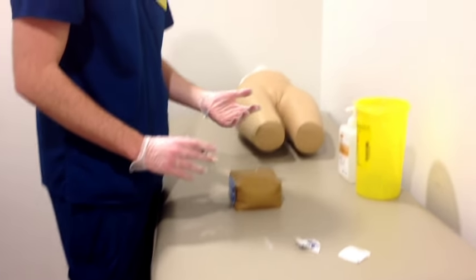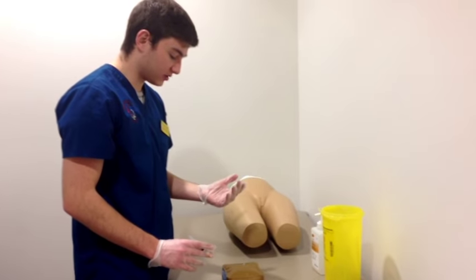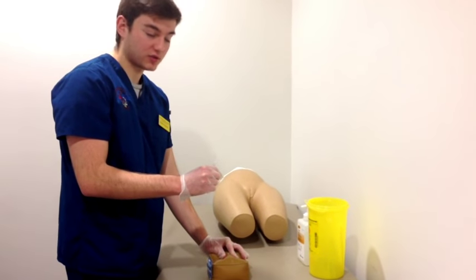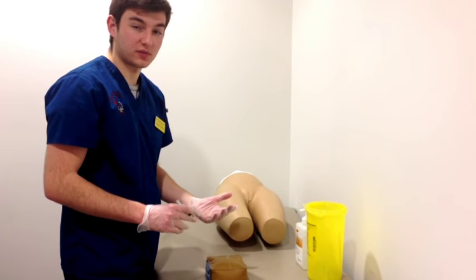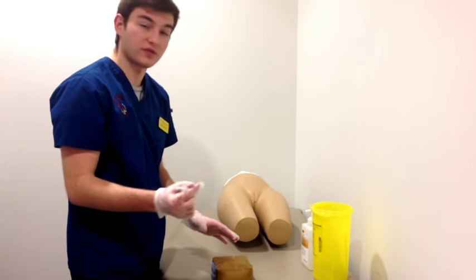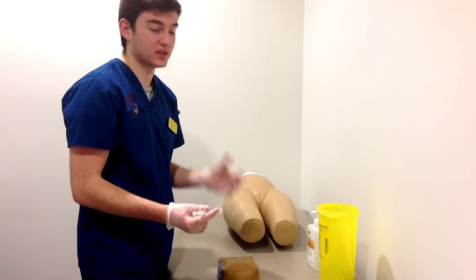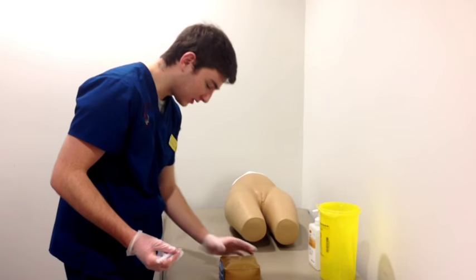So in the case of an obese patient, what you want to do is keep it pinched and inject it 90 degrees straight in for subcutaneous. For cases where they don't have a lot of muscle mass or they're pretty frail, you want to do it at a 45-degree angle. For this procedure, I'll be doing it 90 degrees as it's pinched, so for an obese patient.